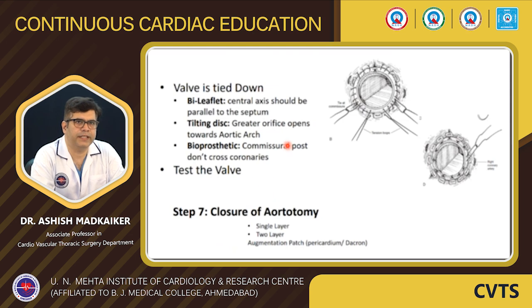So once we have taken the valve down into the annulus, then we should see what is the optimal position of positioning this valve in the annulus. When it comes to a bileaflet valve, we should always aim to keep the central axis parallel to the septum.